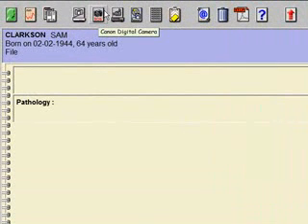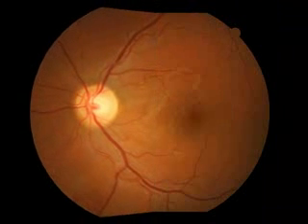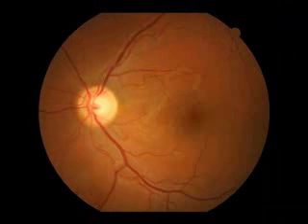Left-click once on the black EOS digital icon at the top of the page. Begin taking images and hit Escape to auto-save to thumbnail.